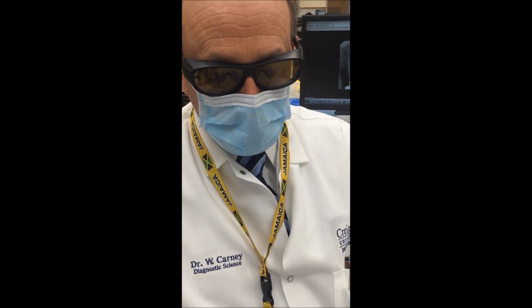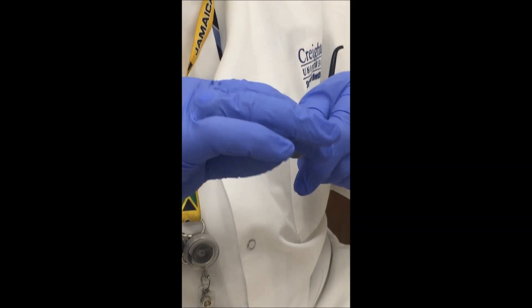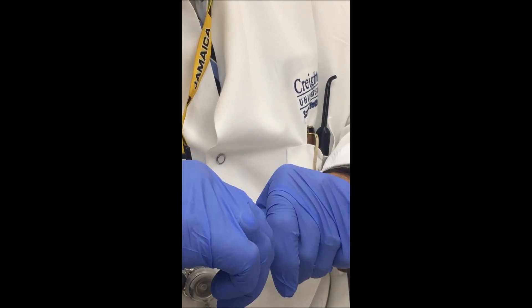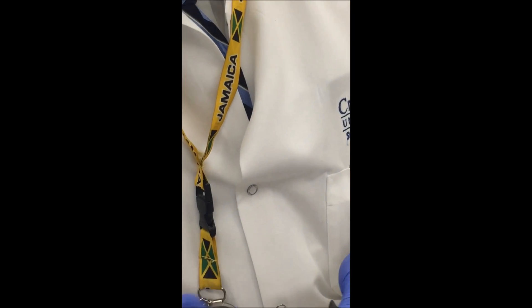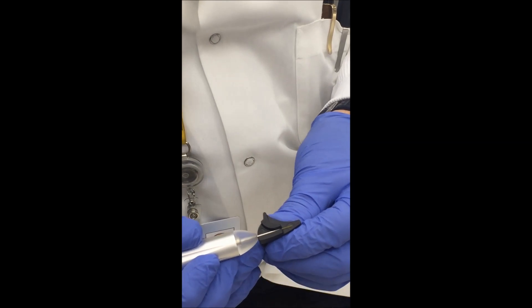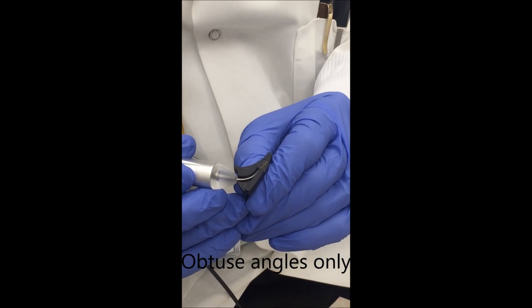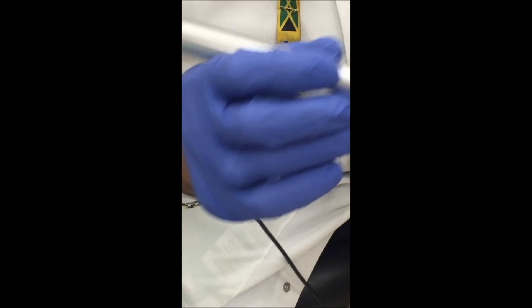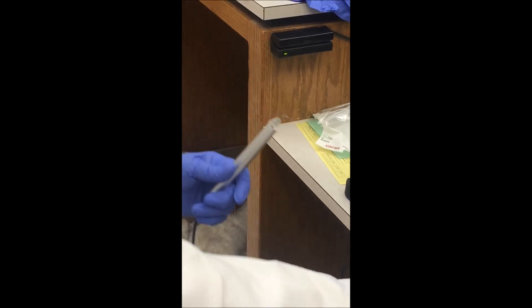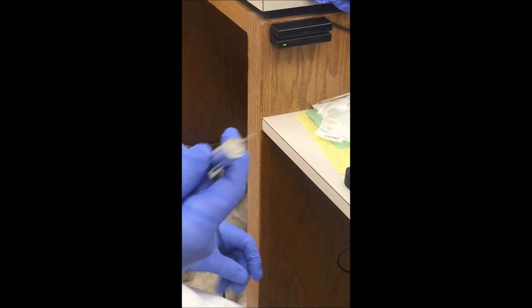This is pretty simple — it screws right into the handle. Get it screwed in nice and tight. It comes with a handy little tip bending device so you can bend the tip without creating too much of an acute angle in it, which would cause the laser energy to be dissipated.